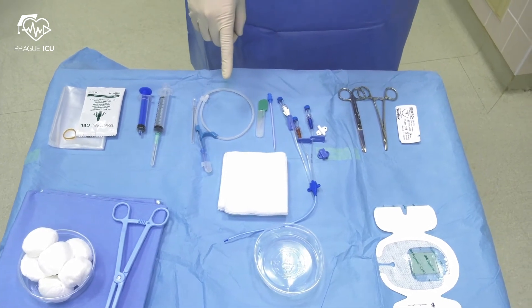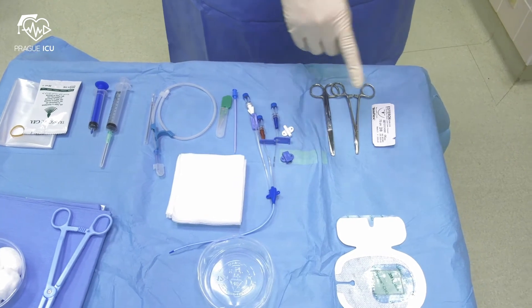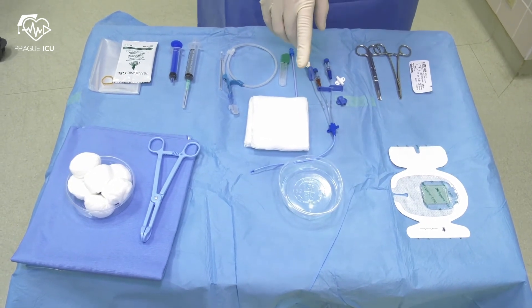scalpel, tissue dilator and the CVC line. Then the suture kit. At the left upper corner, sterile dressing Tegaderm. In the middle of the field I keep a pot for sterile saline and sterile gauze pads.